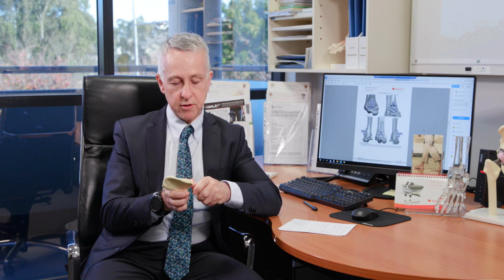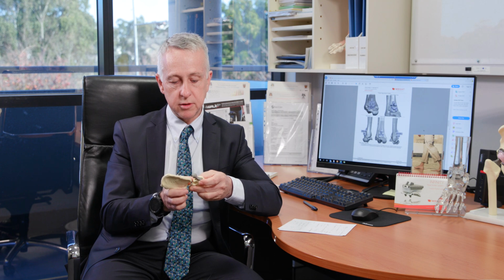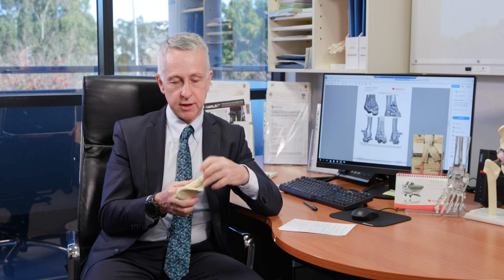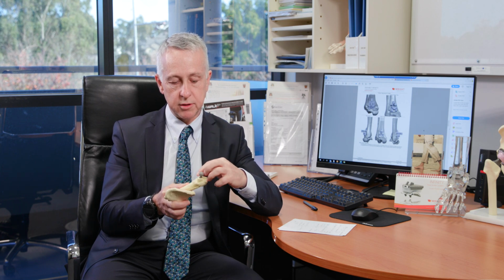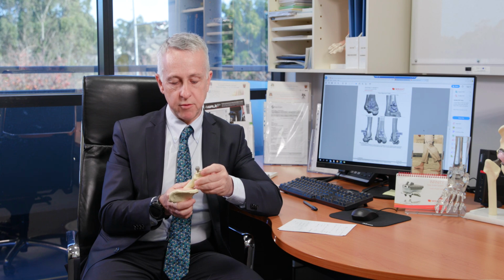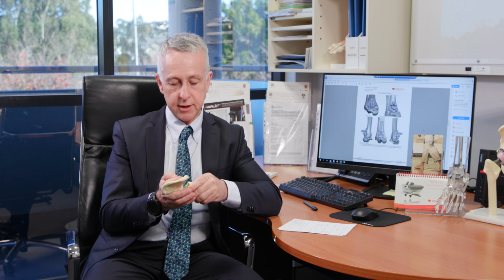The other thing that can occur is a fracture or a crack in the bone with putting a hip replacement in. Often that's just an undisplaced crack like on a hard-boiled egg, and we can put a wire around there to prevent that from getting worse. Sometimes it's more complicated than that.